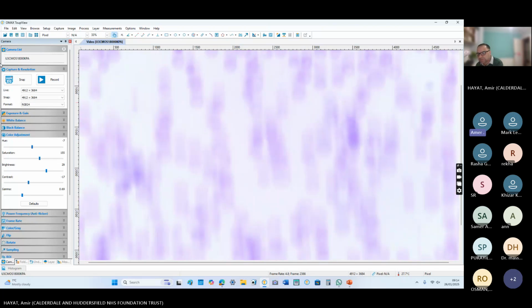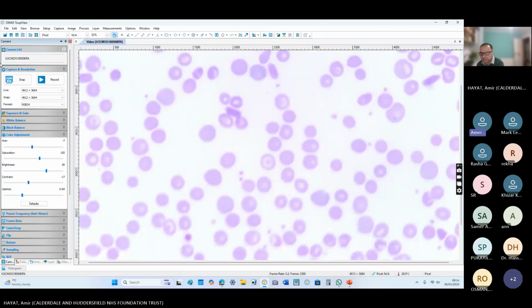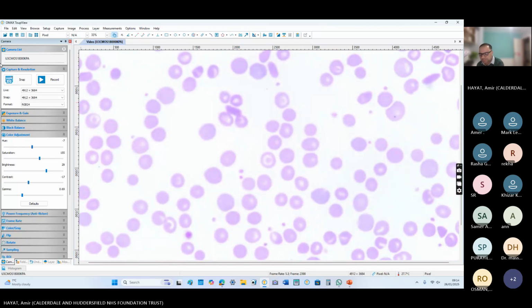Because a sickle cell patient may be iron deficient as well, and iron deficiency can lead to elliptocytes. And this is a Howell-Jolly body. Okay, but why does this patient have target cells? I'm saying it could be a combination. Autosplenectomy in most sicklers.